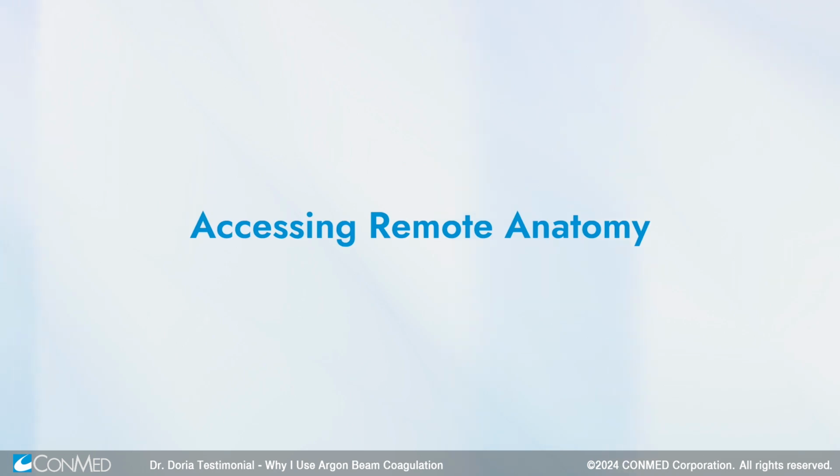The Argon Beam is extremely effective in dissecting tissue in patients with multiple previous surgeries, where lots of scar tissue is encountered during the dissection. And I can go very carefully through this scar tissue using the Argon Beam Coagulator.